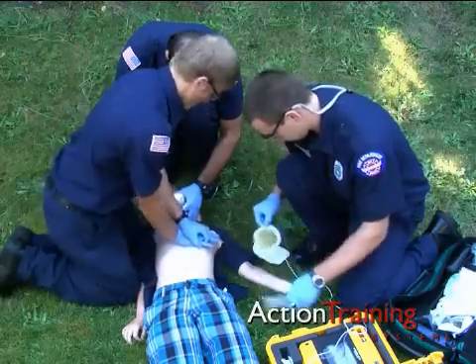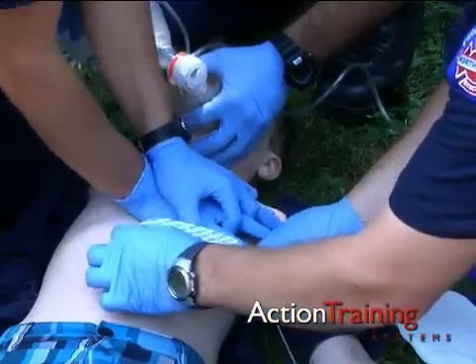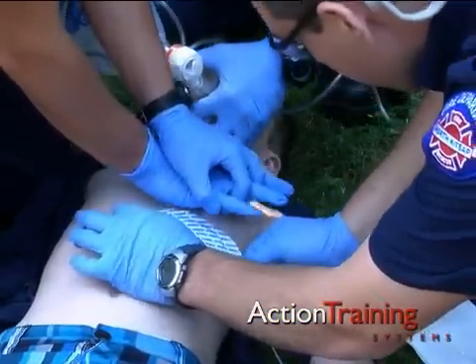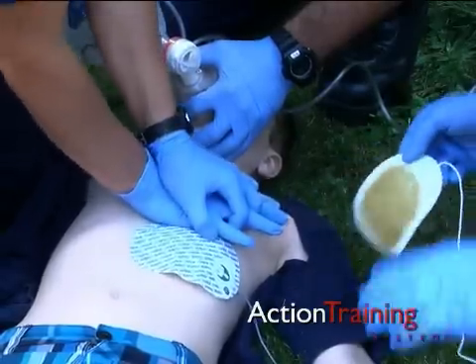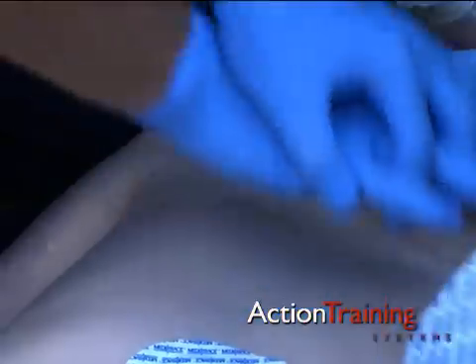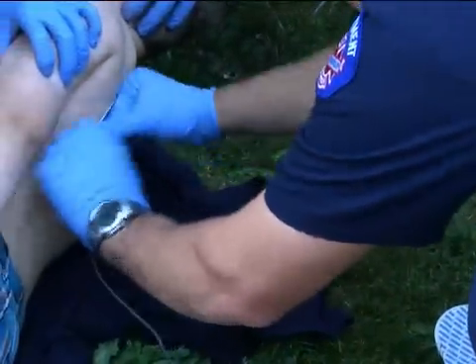Use AED pads designed for children. If you do not have smaller pads, use adult pads if they fit on the chest without touching each other. Follow your local protocols and the manufacturer's guidelines for placement of the pads on pediatric patients and related guidance. Adult pads can be placed on the patient's front and back if they are too large for the child.